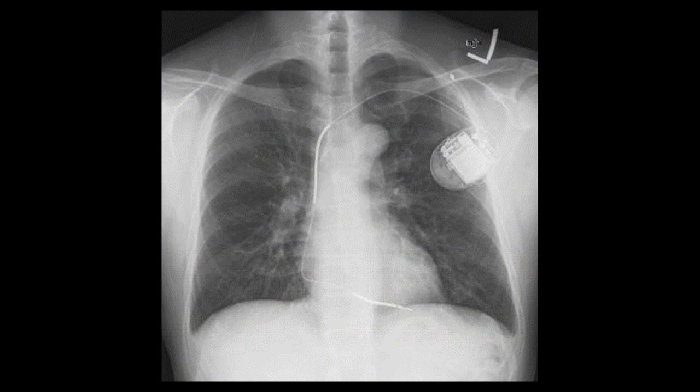Here's what a single lead ICD looks like on chest X-ray. Here's the generator, which is a little larger than a typical pacemaker, as it also needs to include a capacitor to store the shock charge. And then along the course of the ventricular lead, you can see 2 stretches where the lead looks much thicker. These are the shock coils. The upper one sits in the superior vena cava, and the lower one in the right ventricle.